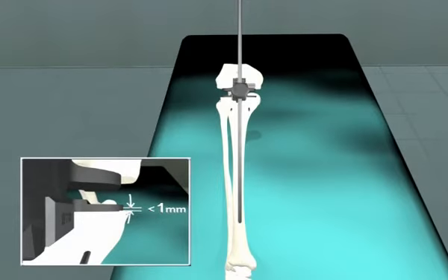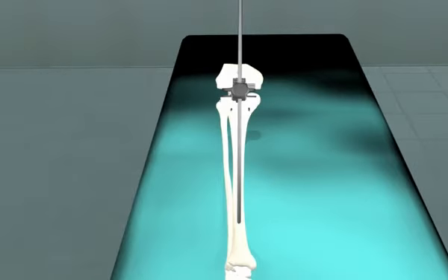The guide can be used to assess the medial and lateral compartment tension. The compartment tension can be assessed with the spacer block in place and by rocking the alignment rod medially and laterally to assess a maximum of 1 millimeter of separation between the tibial surface and the guide. This gives a proper flexion tension.